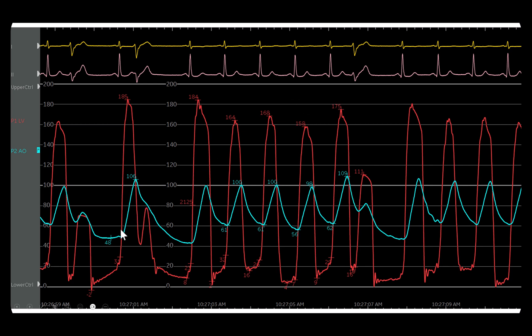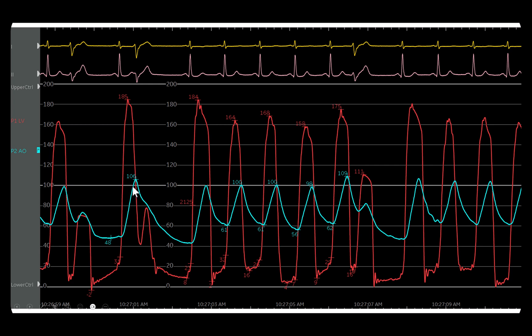But if you recall the pressure waveform, this was not right — it seemed a little sluggish. This confirmed pulsus tardus, meaning a retarded upstroke. One should see the upstroke of the arterial waveform go up very quickly, but instead we had the classic pulsus parvus et tardus. We can also see the phenomenon after a PVC where the LV pressure goes up, but so does the aortic pressure. Interestingly, the diagnosis of severe aortic stenosis was made in the cath lab in a patient sent for PCI of an LAD CTO. This matches his symptoms of mainly exertional dyspnea. The patient was referred for TAVR.